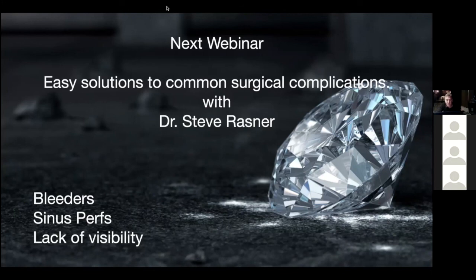How do I feel about physics forceps for atraumatic extractions? Okay, I hope you're not the owner of the company, but I hate them because they break off buccal bone. They exercise in principle the concept of creep that I told you about. Maybe it's me. Maybe I have bad hands. I don't know. I have found many clinicians to echo what I've just said to you.